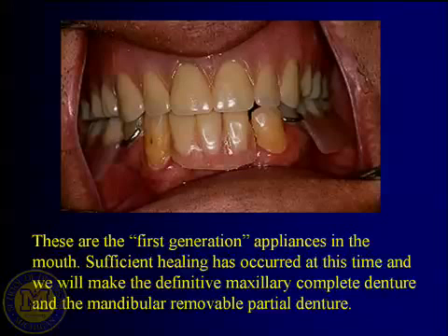What did you think about the aesthetics of your upper denture? Maybe they loved it, maybe they hated it. But can you see that the pre-existing denture gives you some sort of a yardstick or a guideline as to what changes you might like to make for the new denture?